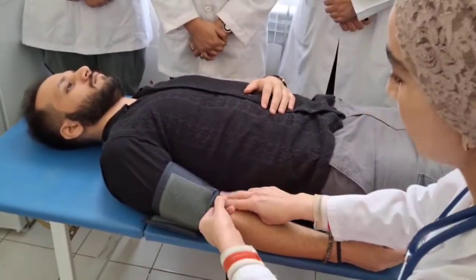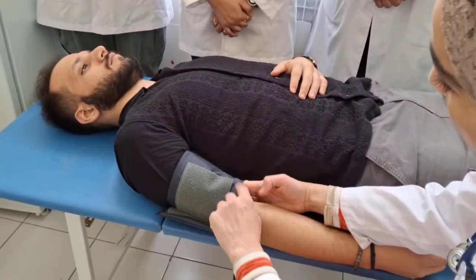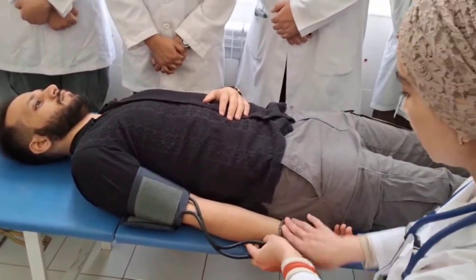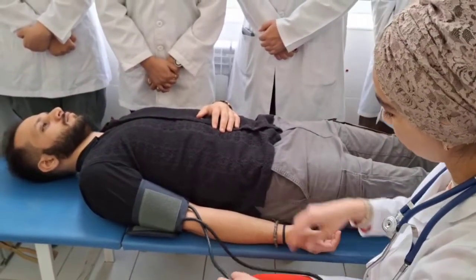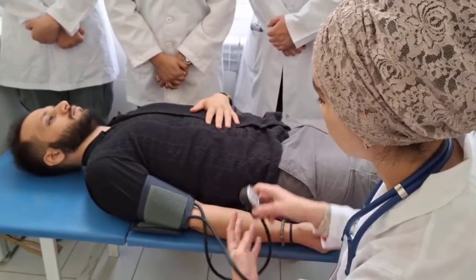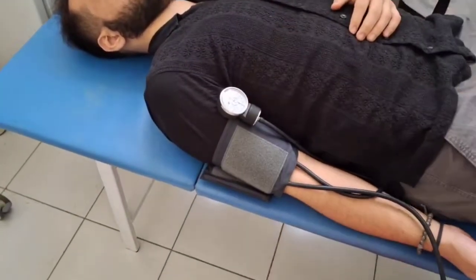The lower part of the cuff should be located two fingers above the cubital space, and there should also be two fingers of space between the arm and the cuff. The arm should look upward and slightly outward. The manometer should be fixed at the level of the heart to stay visible.